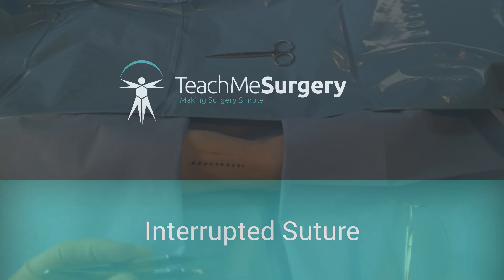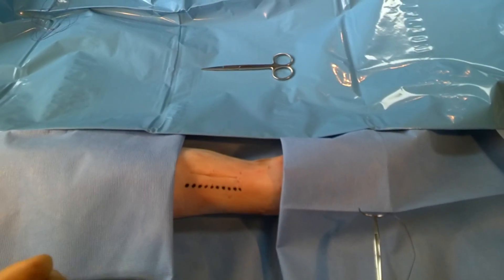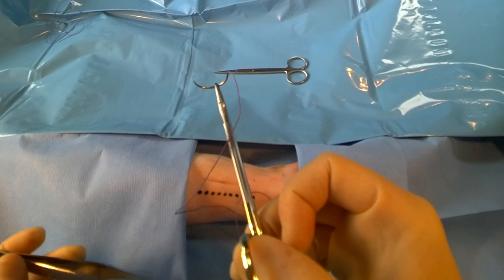In this video, we're going to demonstrate how to do an interrupted suture. What we've got is some scissors that you can see up there, some two forceps which you can see here, our needle holder, and there's a curved needle that you can see sitting in it.